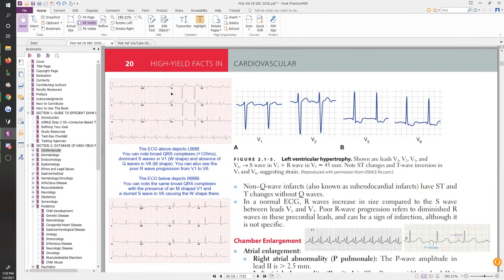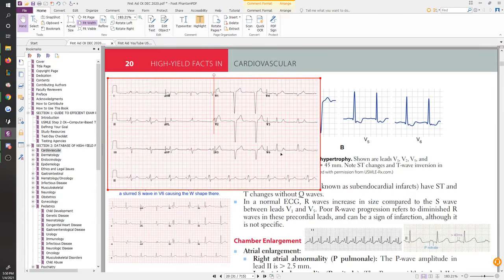And you would also suspect that the V1 to V3 leads are going to be a lot stronger impulse than the V4 to V6. And you see that, right? You can see that, right? You see how V1 is super tall, covers almost 1, 2, 3, 4, 5, 6 different boxes. It's such a tall QRS complex that it's almost about to go into the next line. V2 is also super tall. V3 is actually pretty long. And then on the other leads, V4, V5, and V6, they're very tiny.